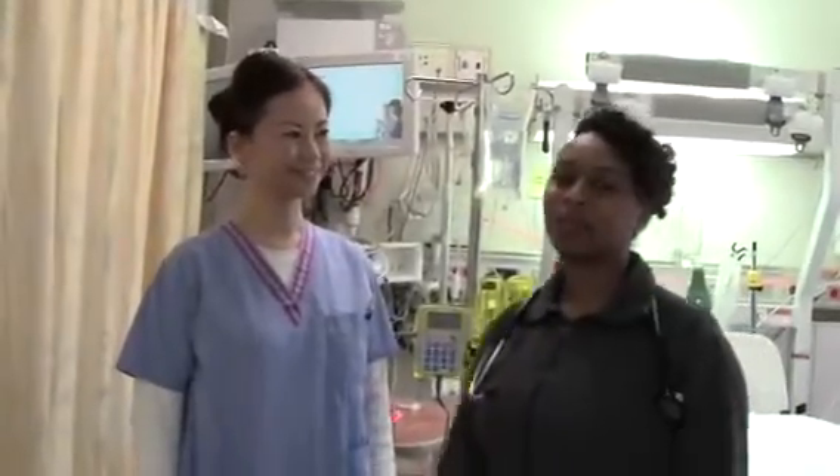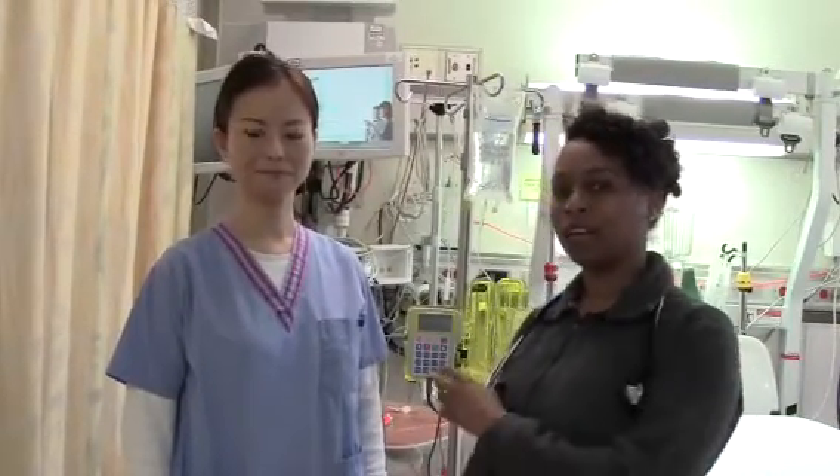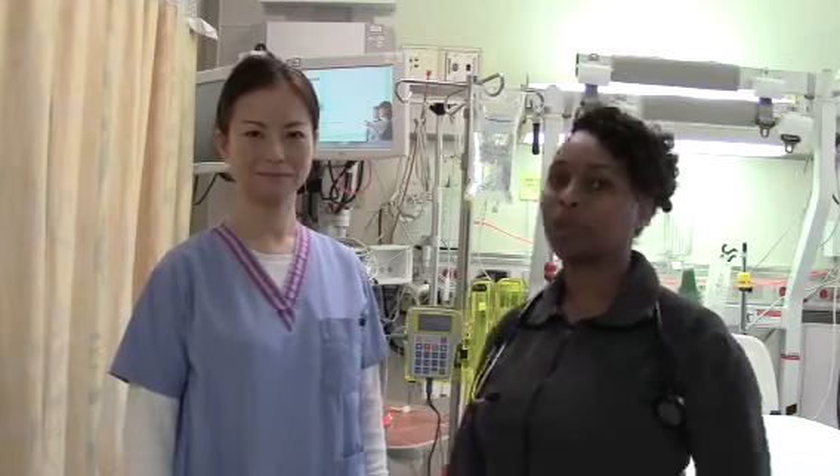Hi, this is Angela and Hiroko again. We're here to show you, once you set up your IV epidural, how to program the pump.